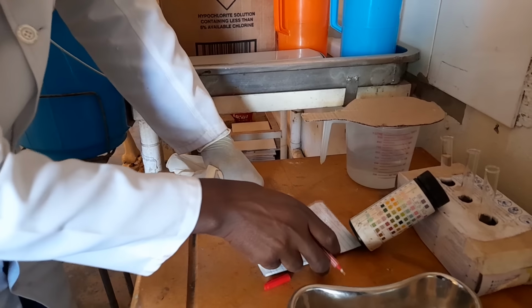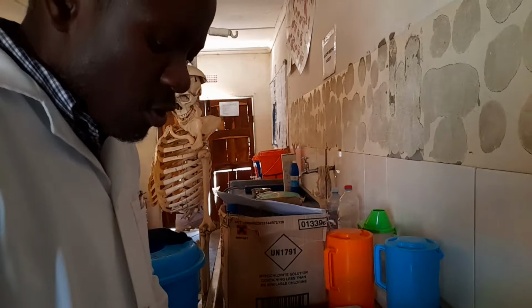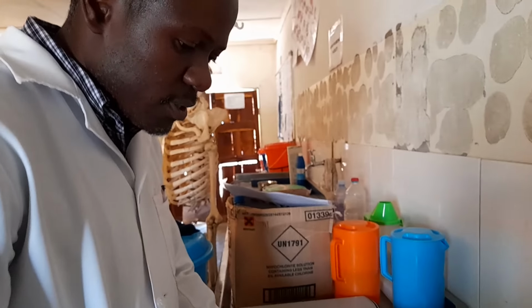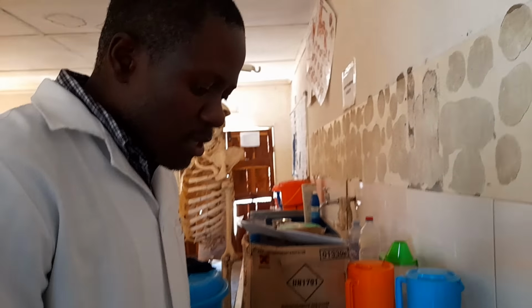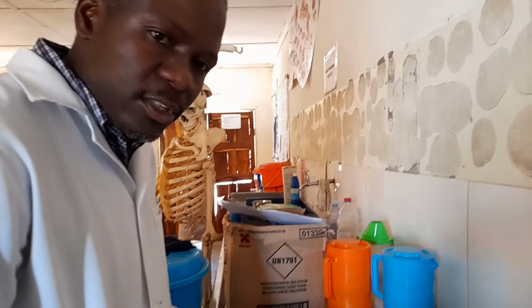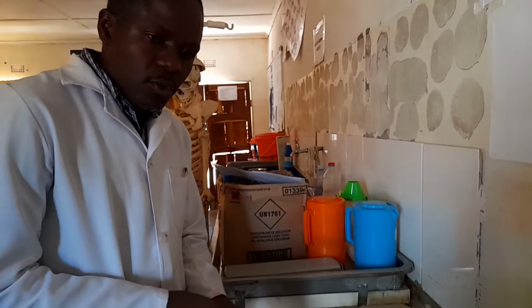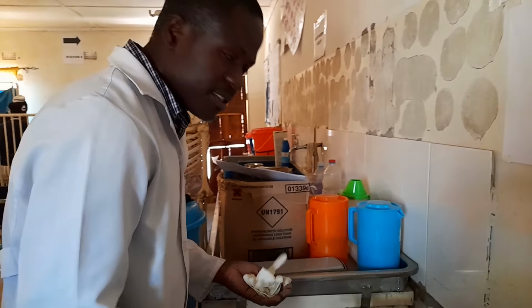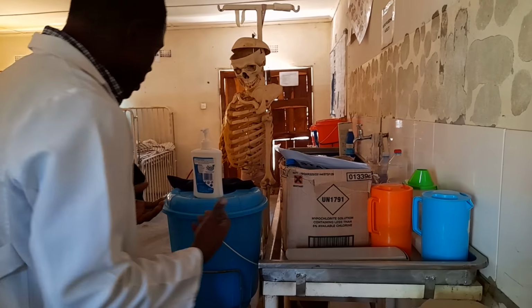So meaning this, you have to even give it to the ward in charge or your examiner to say these are my results, because the time you were saying the results, the examiner was able to get it. So you'd even now conclude with the examiner that you have done urinalysis, and these are the results. So it even goes now to the last point of hand washing. So at this moment, you can even now hand wash.